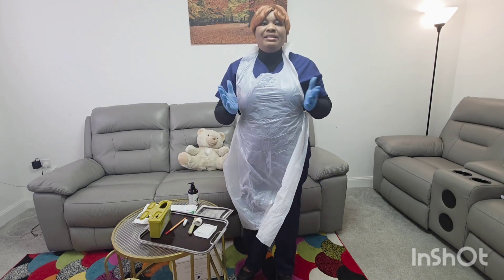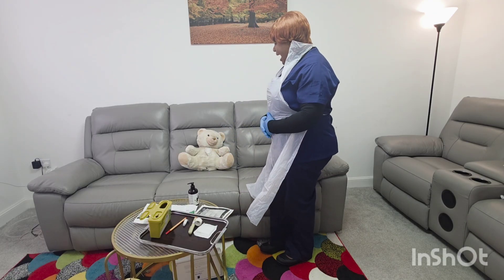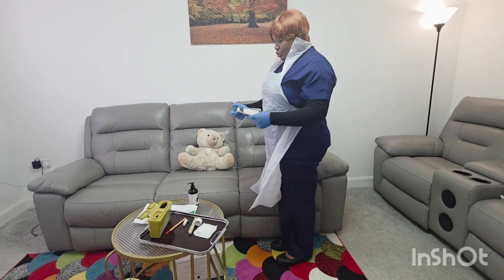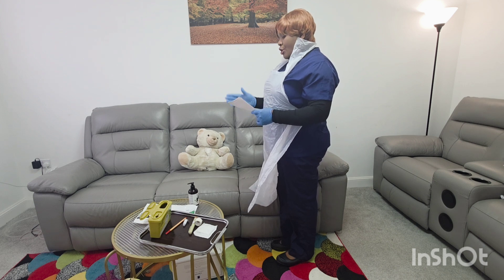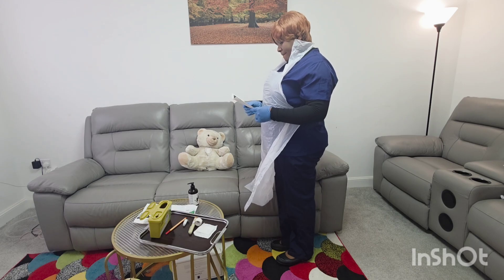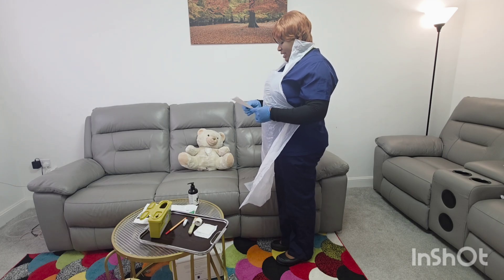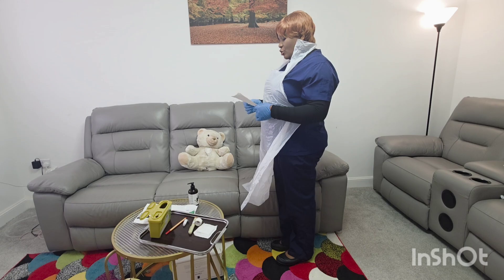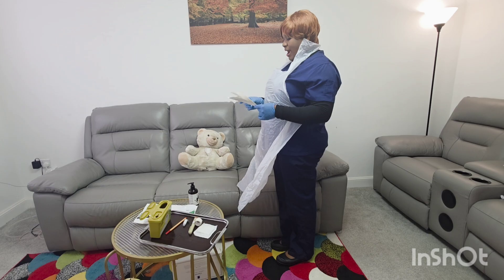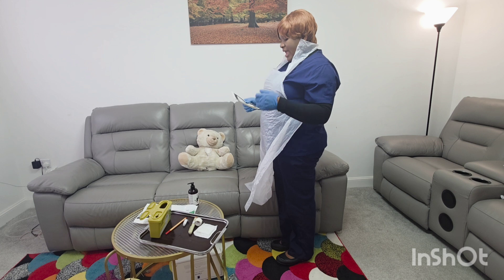I will take this and go back to my patient. Hello, Mrs. Ailey, I am back. Are you still happy for us to continue, please? — Yes, ma'am. Beautiful. Can I just ask you to reconfirm for me a second time your full name, your date of birth, and your first line of address, please? — Kelly Brooke, 15-1940, One Switch Place. Assessor, I still have the right patient. I can see my patient does not have any allergies. Assessor, I have completed all the rights of medication: right patient, right drug, right dose, right route, and right time.